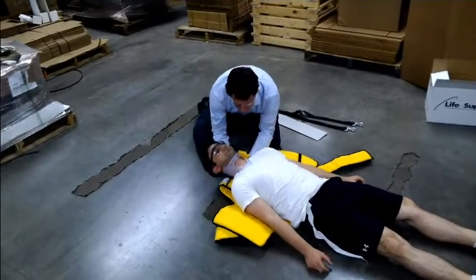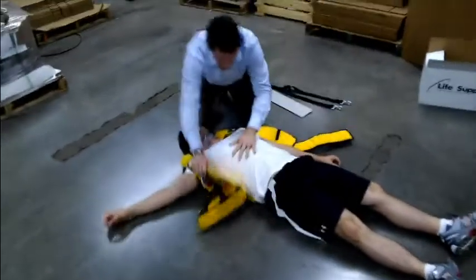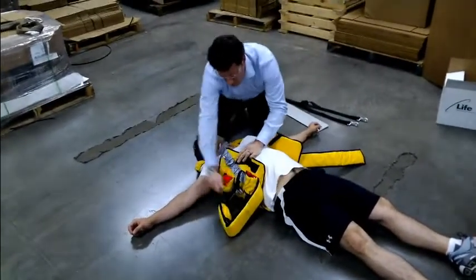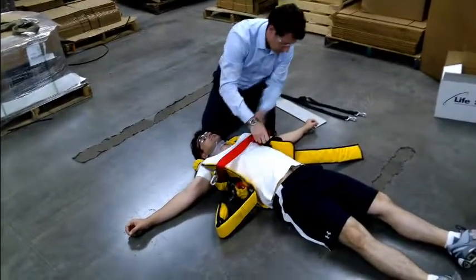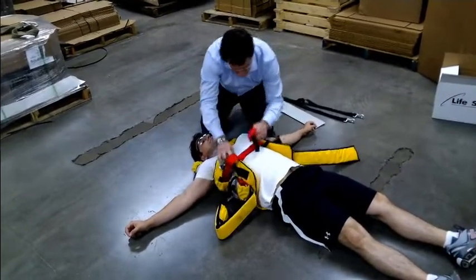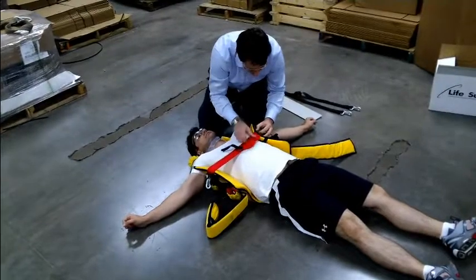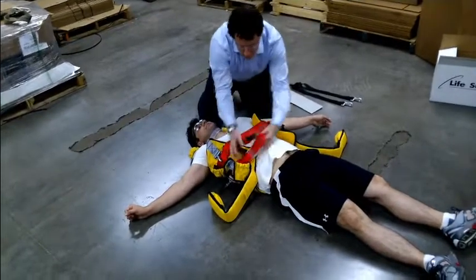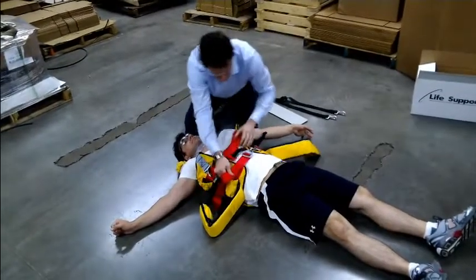The vest is inserted until the patient's shoulders are aligned with the shoulder straps. Next, undo the red torso straps and connect the top strap with the top buckle. Both the top and bottom torso straps are red, but the buckles are color-coded: the top one is black and the bottom one is bright silver so they can't be mixed up. Attach black to black and silver to silver.